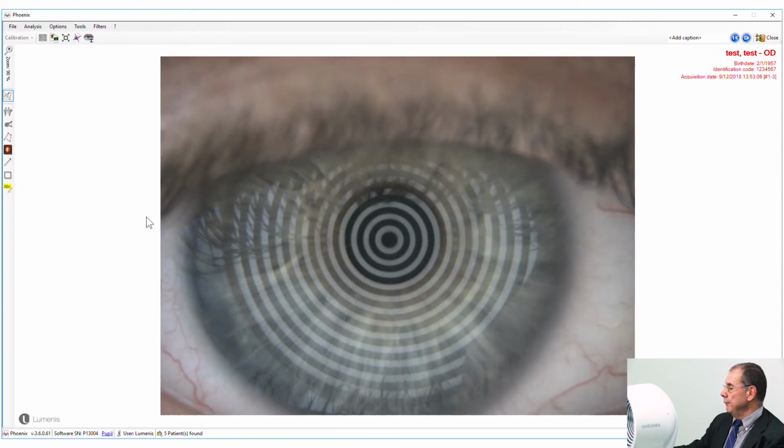So if the image was slightly underexposed or overexposed, we can make a correction. When we make this correction, we can see it on the screen, but it will not save it. As soon as we go out of this image, it will not be saved. The images are saved exactly as they are made. It's not doing Photoshop, it's just allowing us to image better what we're seeing.